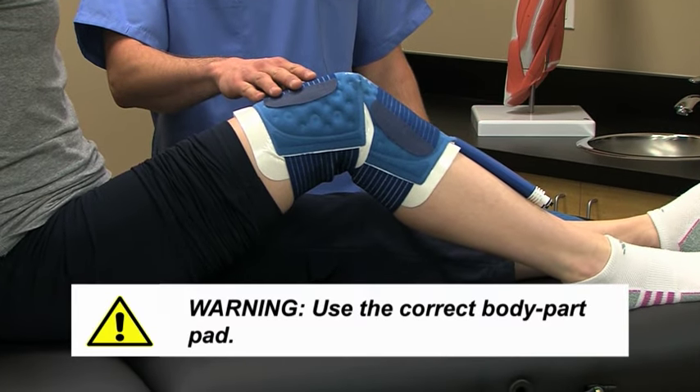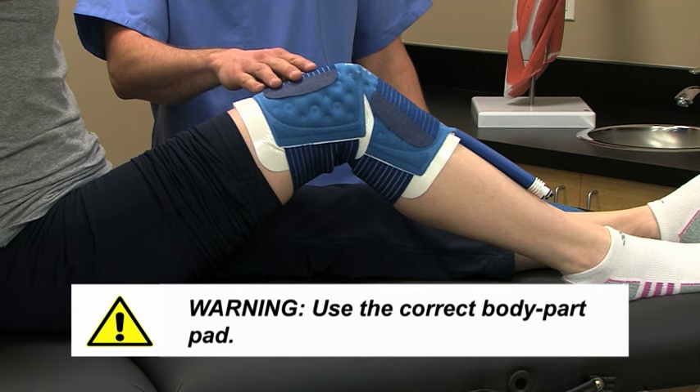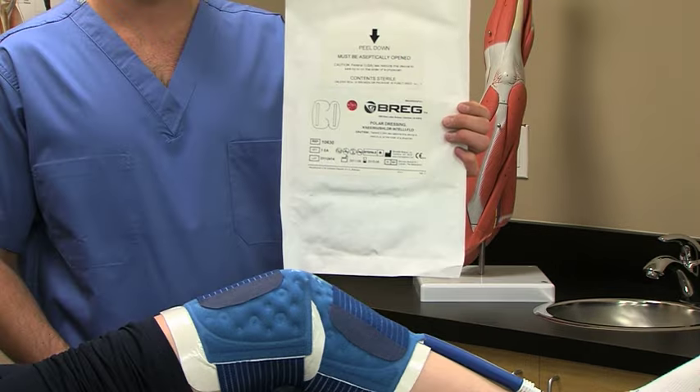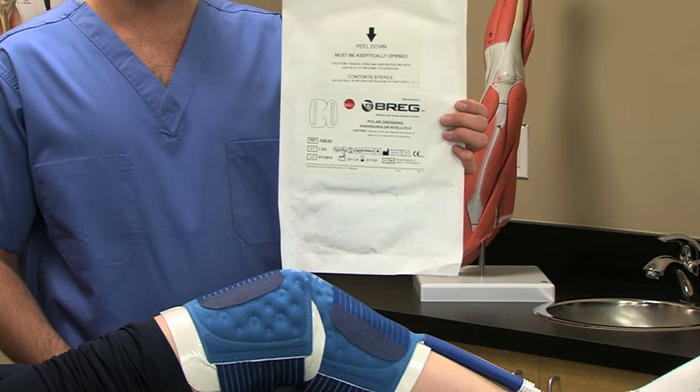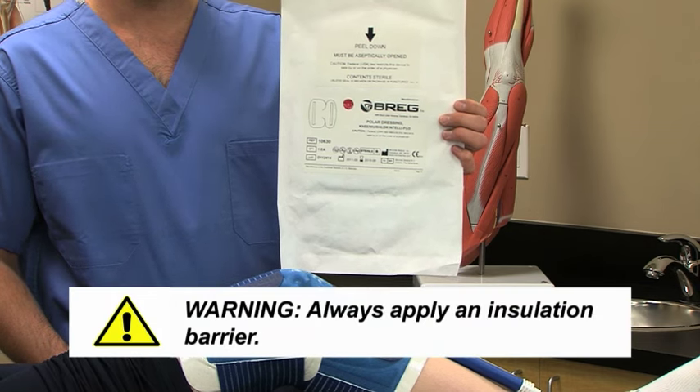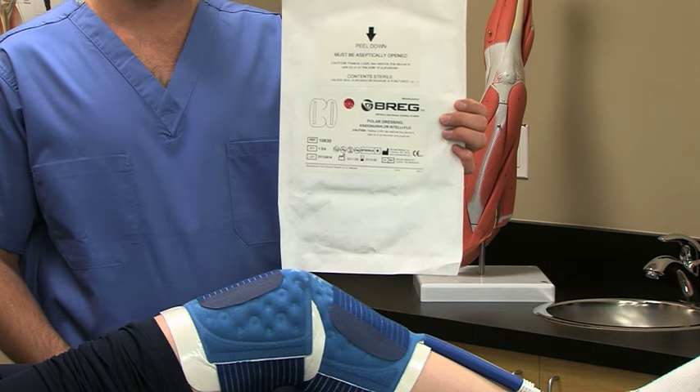For patient safety, it is essential to use the pad designed specifically for the body part being treated. To apply the pad, always use an insulation barrier between the pad and the skin, like a Breg Polar Dressing, Webrel, Curlix, Cast Padding, or an elastic bandage.